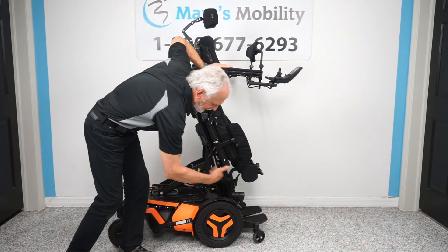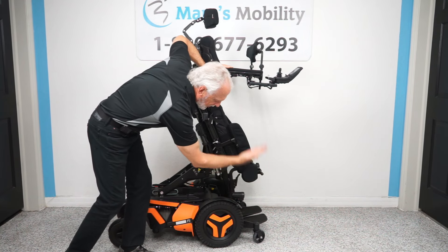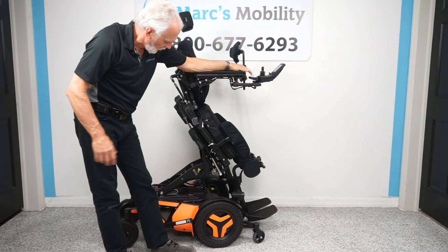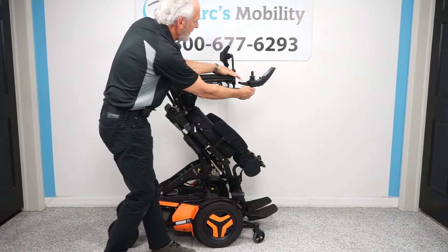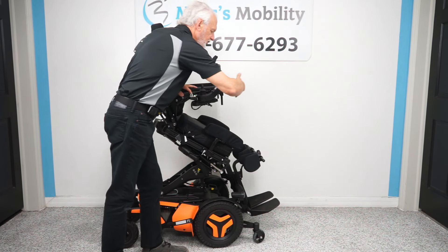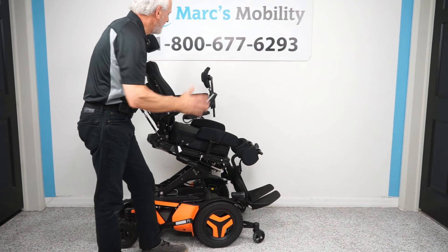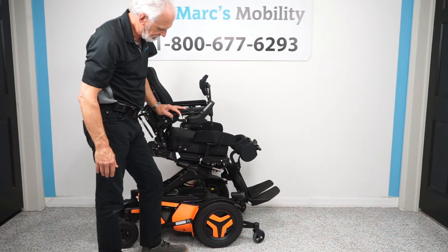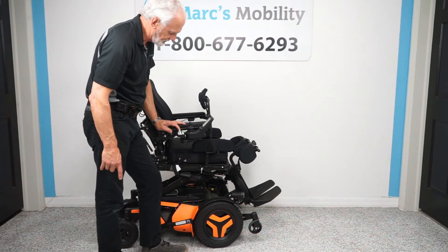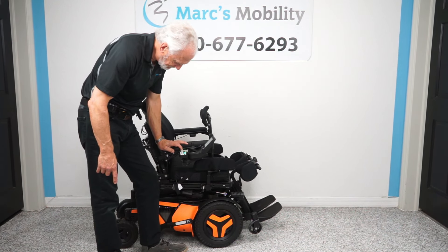This is a front-wheel drive chair, meaning your drive wheel is up front. Usually there are no wheels on the ground, but this one has the anti-tip wheel down because the seat is in the standing position — as soon as the seat goes down, that wheel comes off the ground. So we're going to bring the seat back down. Also, it has a swing-away joystick: you can take the joystick from the front, bring it to the side, and get a lot closer to a dining table. If you're left-handed, we can put the joystick on the left side.